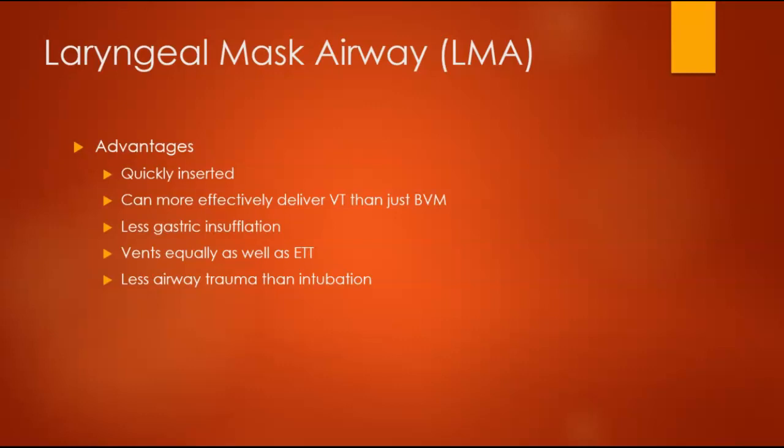Okay, so advantages of it again are quickly inserted, more effective delivery of your tidal volumes to your patients rather than just the bag mask ventilation. Less gastric insufflation, meaning my stomach's not going to fill up with gas as much because I'm going to do more directed ventilation to the trachea.